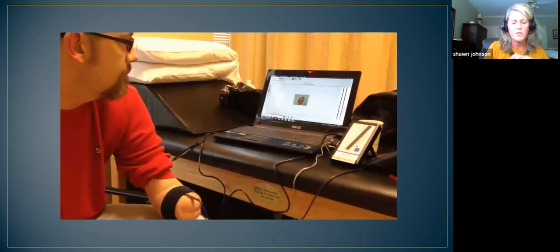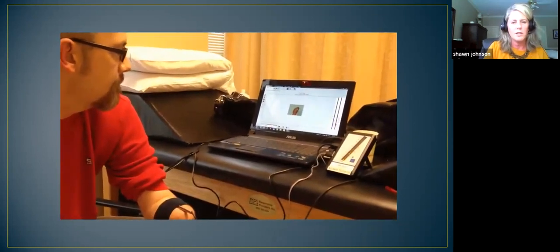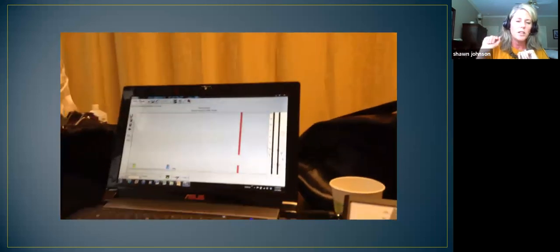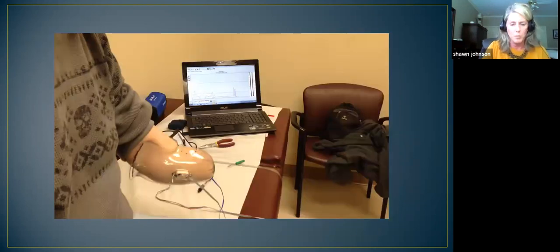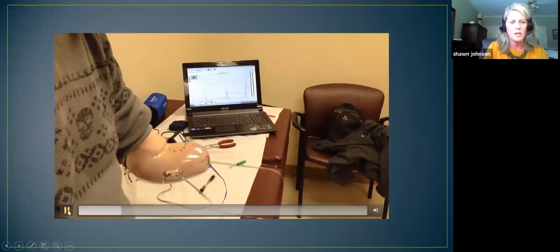So this is a first day scenario. Maybe later on during the session or the next day, we can look at raise your arm above your head, raise your arm out, move it out to the side, move it down. What is the socket? And maybe helping you guys find the appropriate sites. So here's an example with a test socket on a couple sessions later.